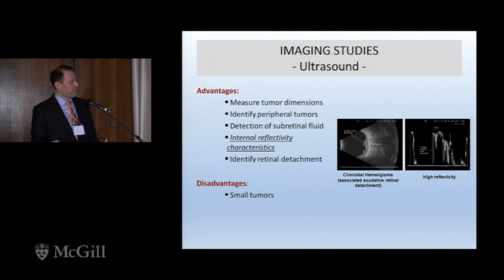Some of the disadvantages of ultrasound: you need a pretty skilled technician to perform these tests. And in addition to that, for very small tumors that are the size of millimeters, ultrasound doesn't really provide that level of sensitivity.